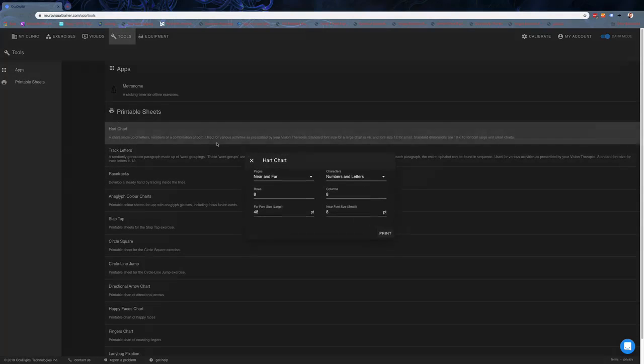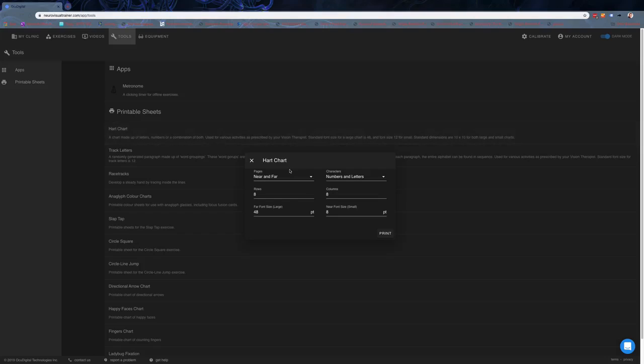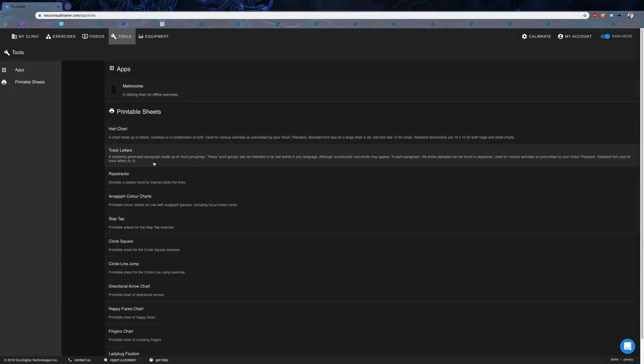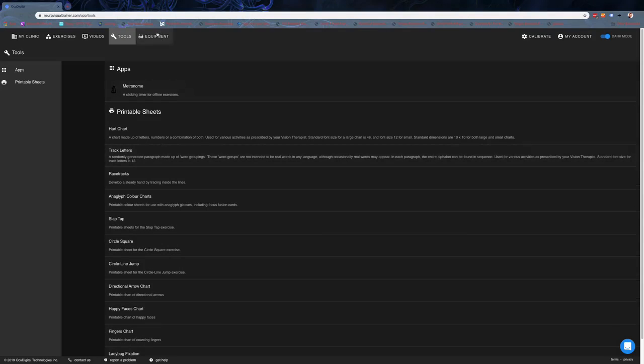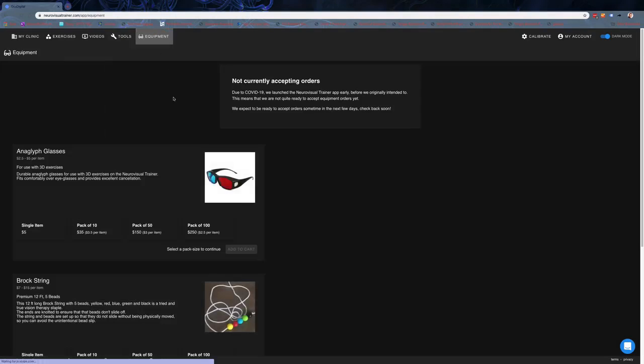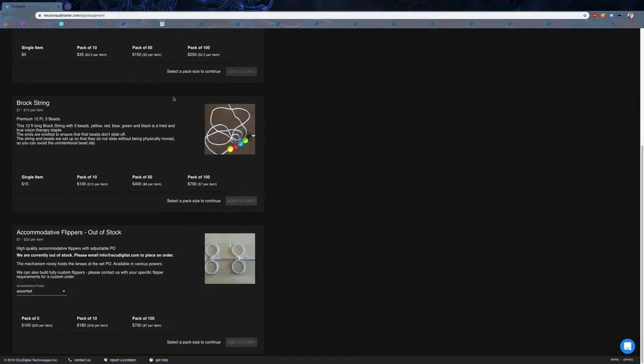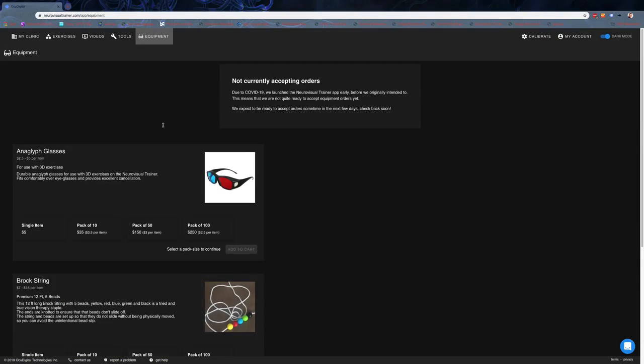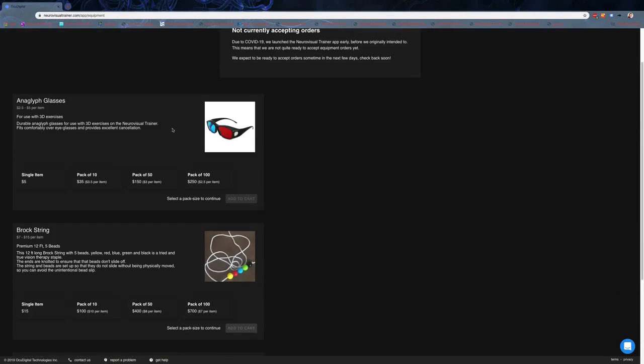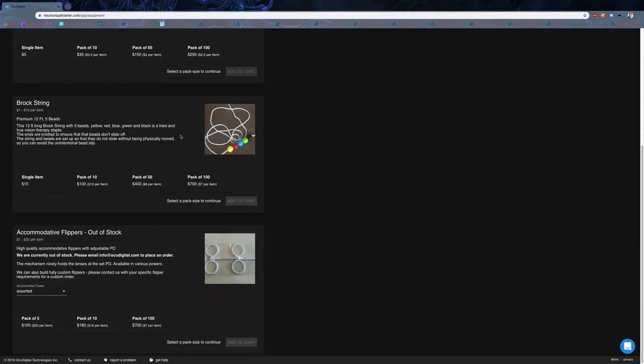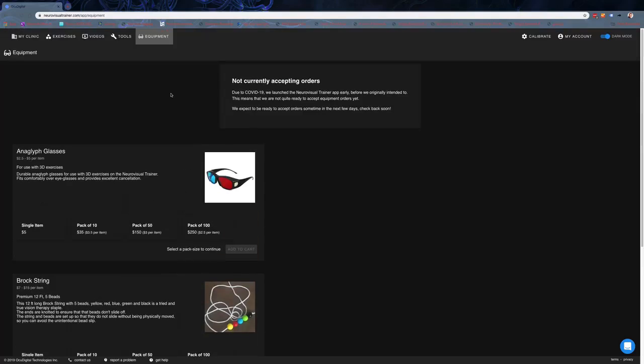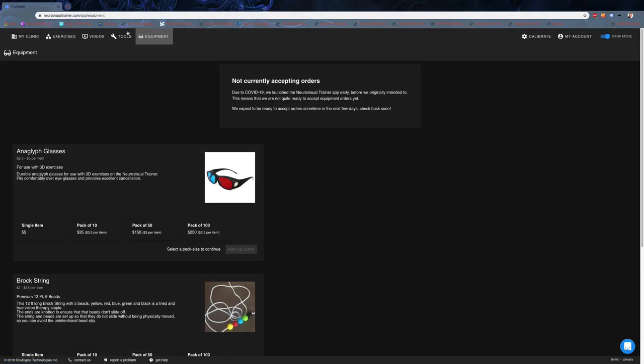Under here as well, there are printable Hart charts and other sheets. This has been really great for those who wind up memorizing Hart charts, so lots of good printable material there. The equipment section is being set up because the NeuroVisual Trainer team is working to source some of these things to help make them accessible and cost-friendly for clinics. I don't believe they're up yet, but I'd expect that soon.